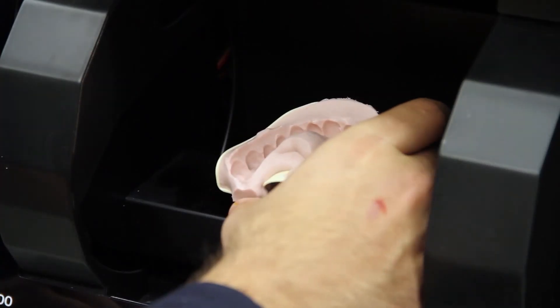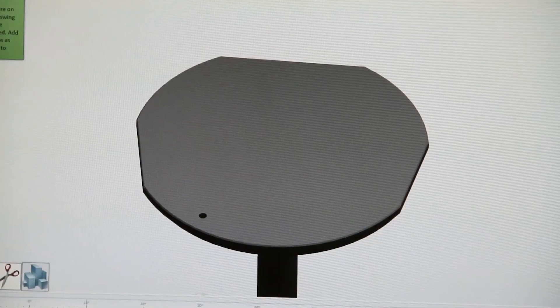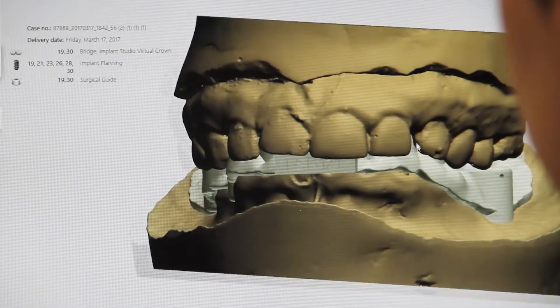We take a lot of digital scans from dentists. Dentists are starting to use scanners more commonly — they basically take a digital image of the teeth. As soon as we get it, we can pull it up on 3-Shape, improve the scan, and get to work on the model.